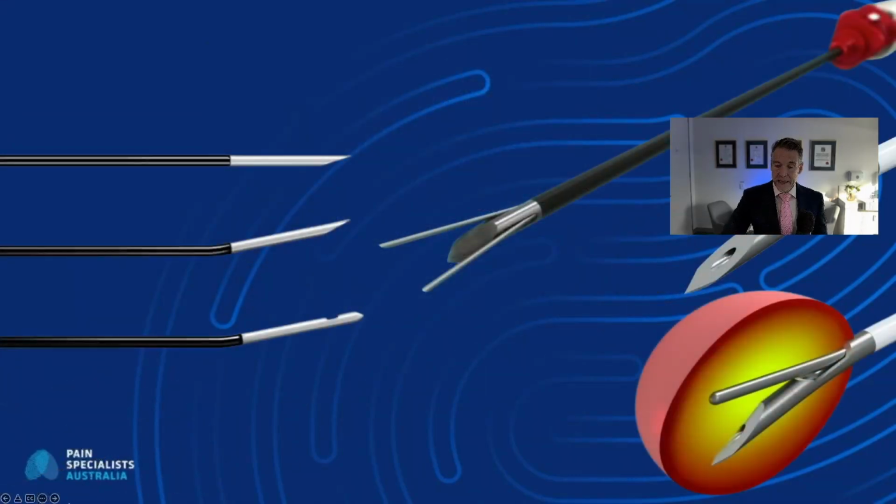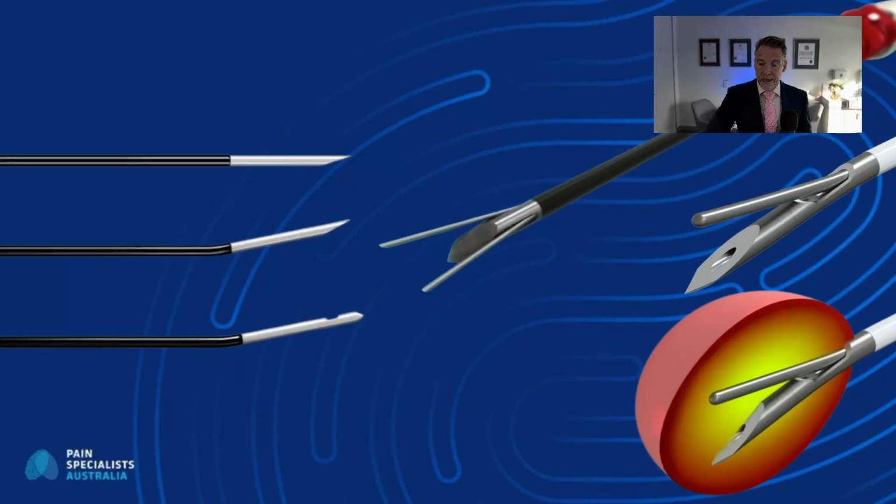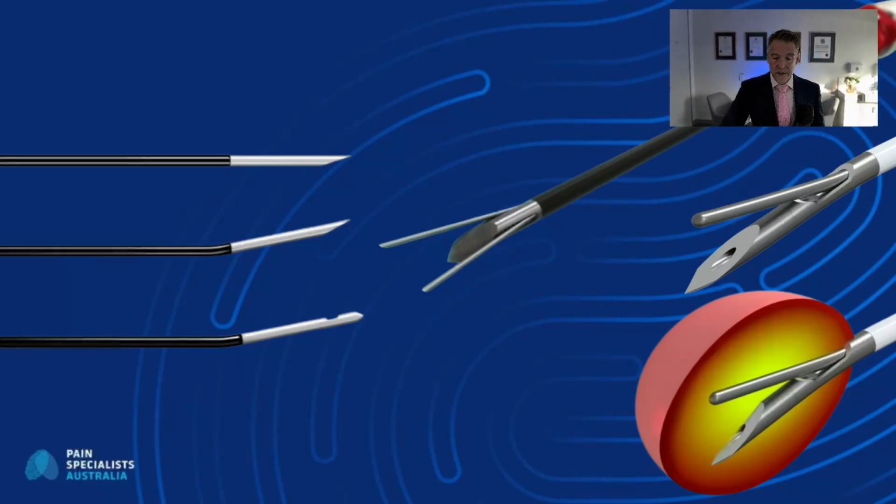So have a look now. You can see there are different types of needles, and the different types of needles allow us to focus different types of treatments in different parts of the body on different nerves. As pain specialists doing these procedures, it is very important, and this absolutely allows us to provide the best treatments for some of the people we treat.